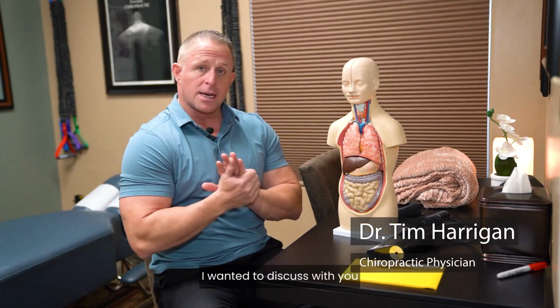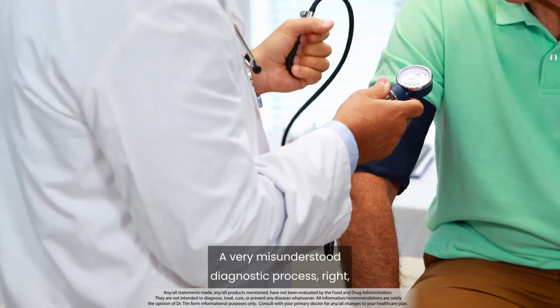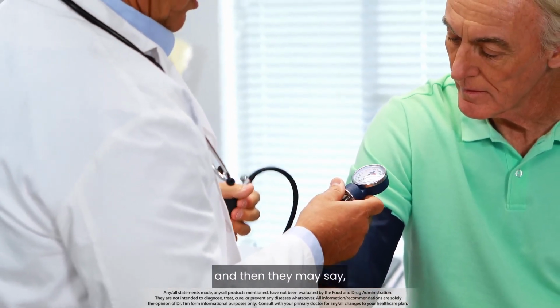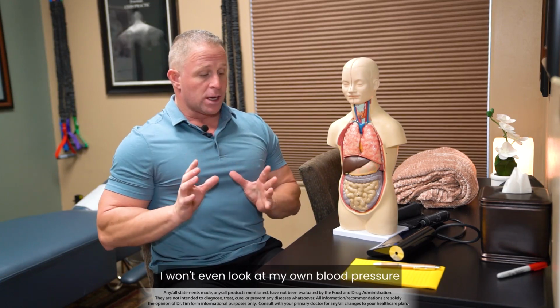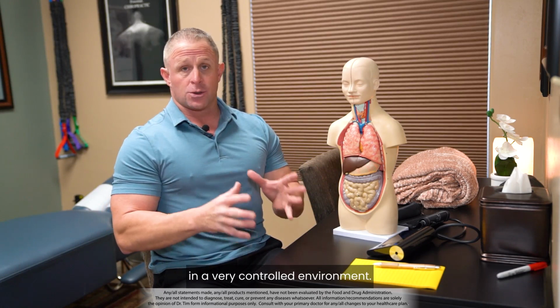I wanted to discuss with you blood pressure today, a very misunderstood diagnostic process, right? Most of us go to the doctor, they check our blood pressure that day, and then they may say I have normal or high blood pressure. Well, there's a few problems with that scenario, okay? I won't even look at my own blood pressure unless you take several averages in a very controlled environment, okay?